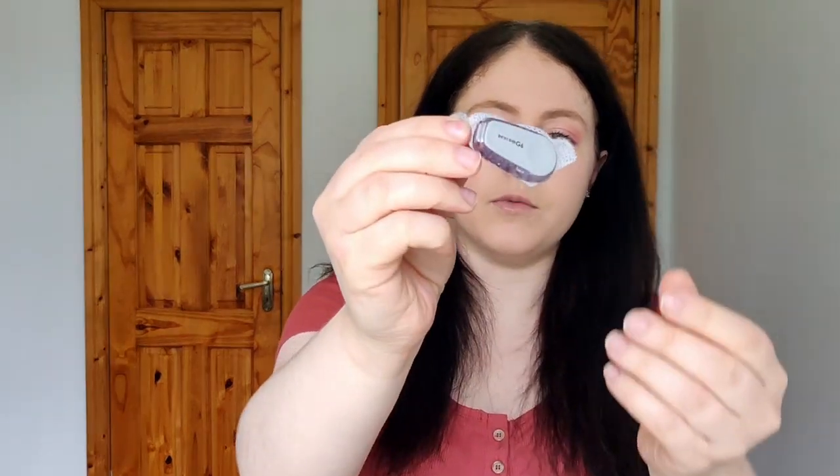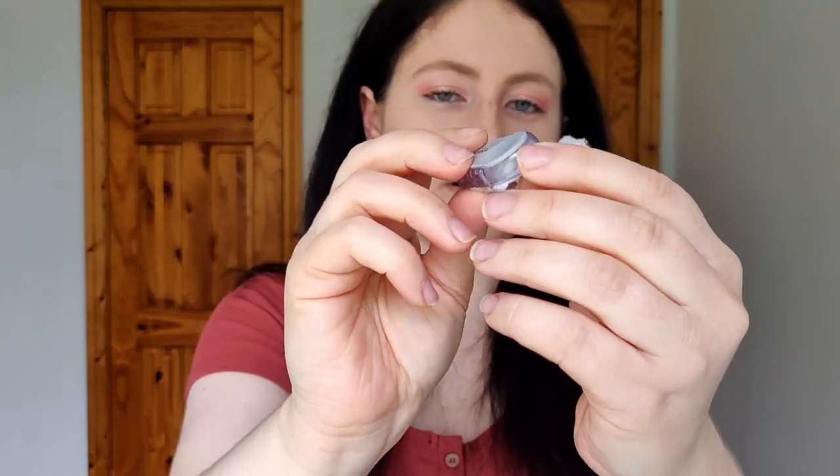I'm currently wearing a Freestyle Libre that was about to expire, but this sensor ends today so I'm going back to Dexcom. My last Dexcom sensor had a transmitter on top, and that transmitter has actually expired. Normally you'd take off the transmitter from the old sensor and reuse it for three months, but this is the very first one I've had and it's now dead — the three months are up, so it's time to do a new transmitter change.